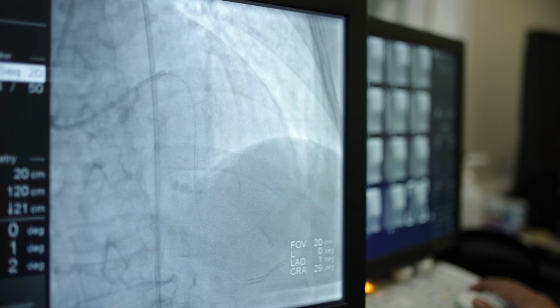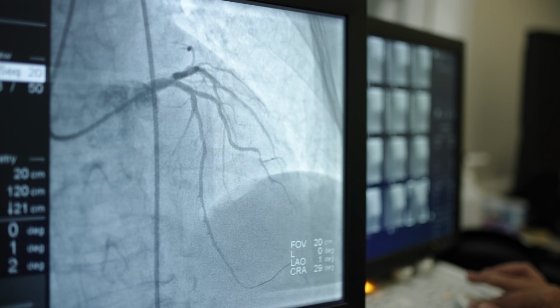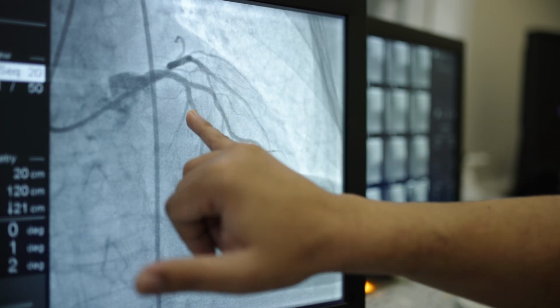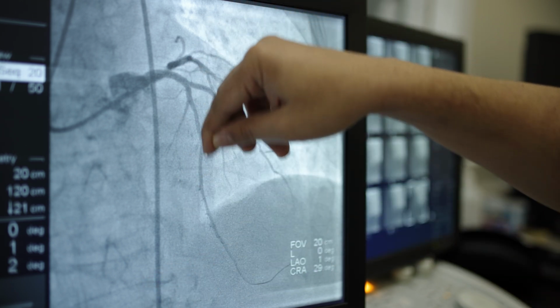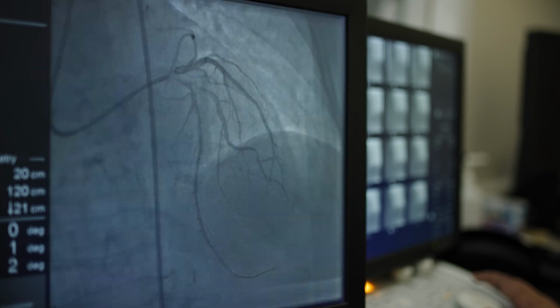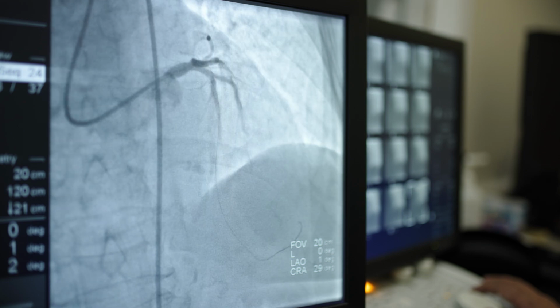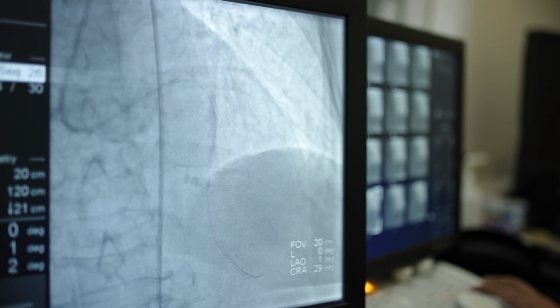This is the ballooning, and then we took a picture, and as you can see, this is the place of the calcified nodule, and when it's ablated, we now managed to go through the artery and even after the lesion. And this is the stent. We are adjusting the stent, and this is the balloon, and so on, and then it showed complete resolution of the lesion.